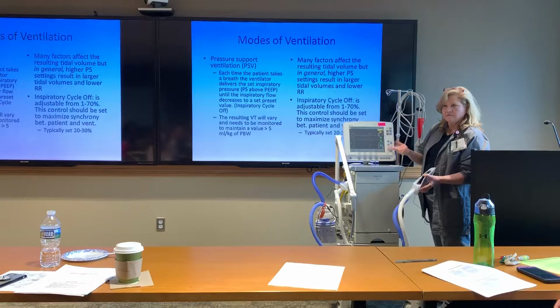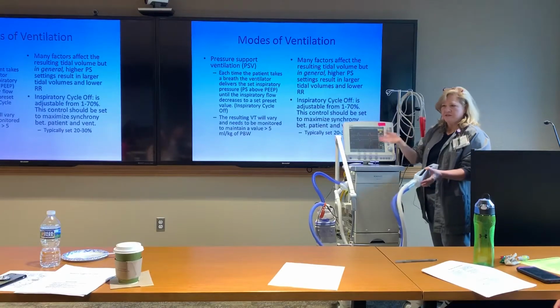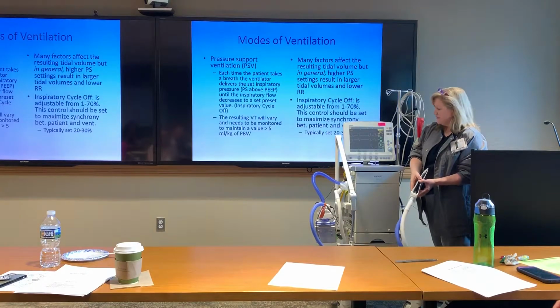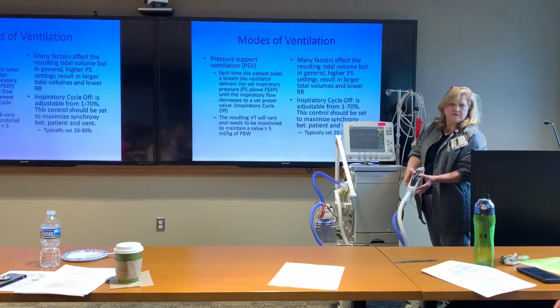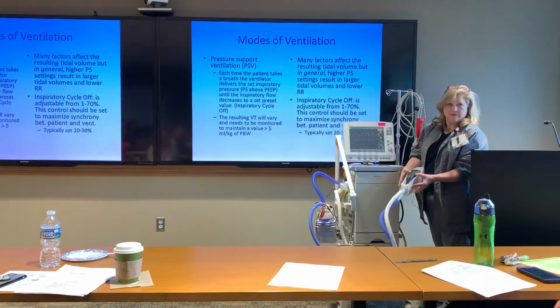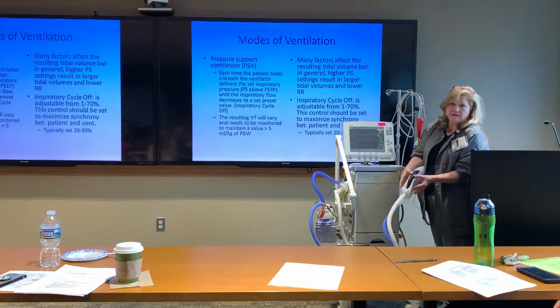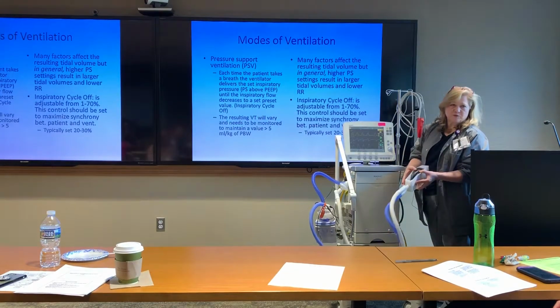And of course, as always, you can't inhale and exhale at the same time, right? So the inspired number and then the expired number will change to what the inspired was. You can't look at them at the same time. Because patients, particularly in pressure support, one breath may be like this, and I might have a 200 breath, or I might do this and get myself almost 600. It really depends on how much effort I'm making as the patient. Same amount of pressure support, but the amount that he gets totally depends on how much effort he puts into it. He pulls in a lot, big volumes. He pulls in just a little teeny bit, he gets little teeny volumes. Same amount of pressure, okay? So that's one of the big variabilities of it. You want to make sure, in general, their tidal volumes should be no less than 5 mLs per kilo.